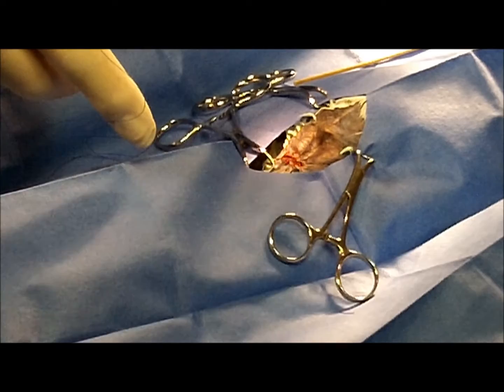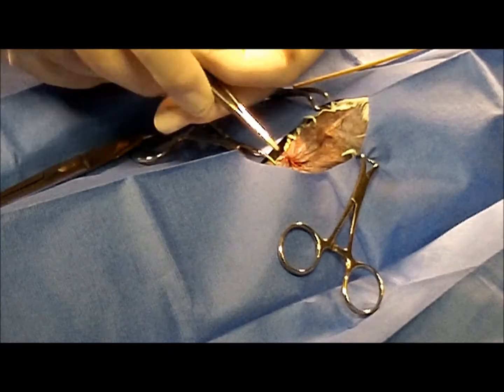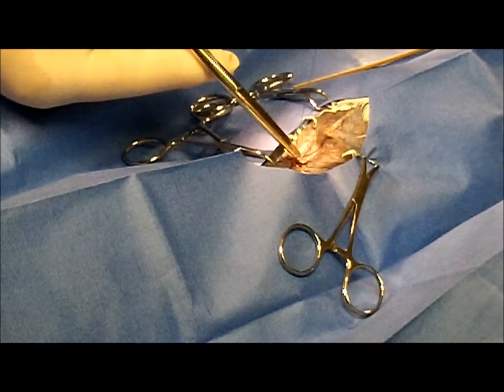He's taking out his finger, and we're going to go ahead and close the skin with a couple of simple interrupted sutures. Still using the PDS suture material. She tolerated that really well — I wasn't sure how she would take it, but she tolerated it really well.